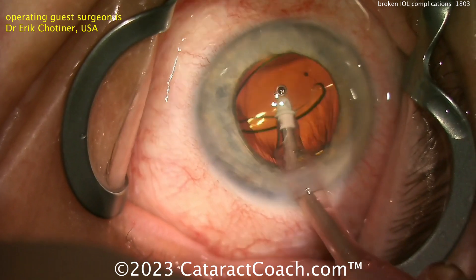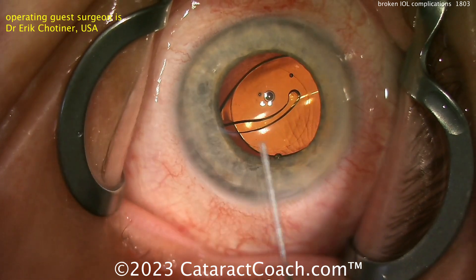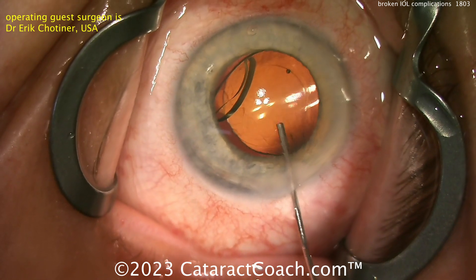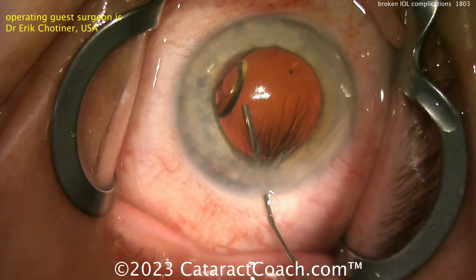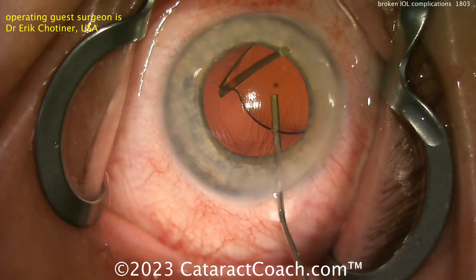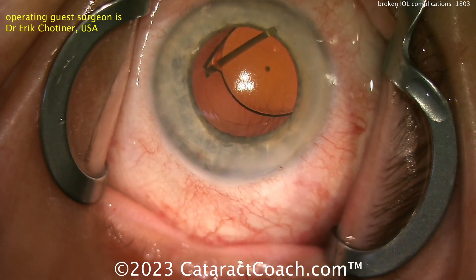Look carefully. The haptic-optic junction is fractured. As this lens was delivered down the injector, it got fractured at the haptic-optic junction. This lens needs to come out — it's not going to stay centered. The surgeon is putting in more viscoelastic, looks like some dispersive viscoelastic, to get under the optic. You can see there's that broken haptic. This lens has to come out. Do not leave this lens in the capsular bag — you can't put it in the sulcus. This thing has to come out of the eye.